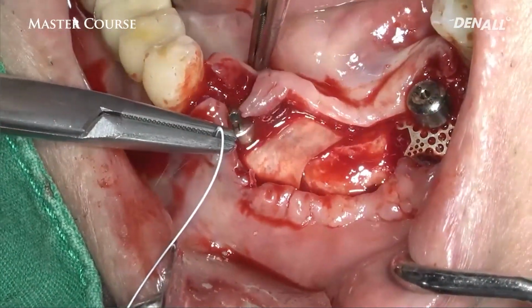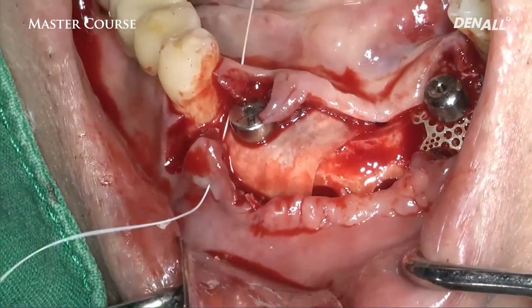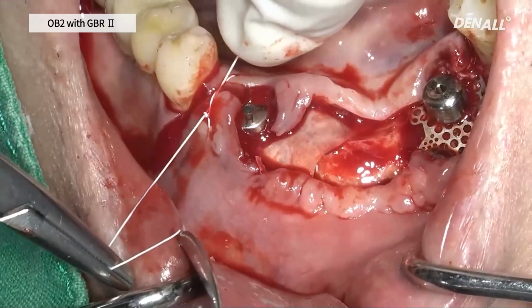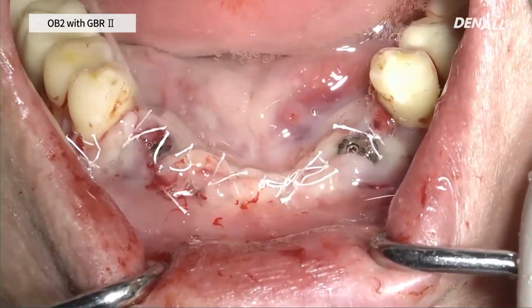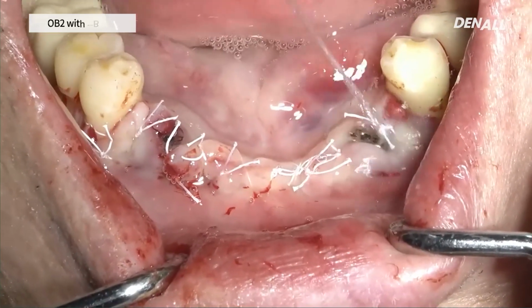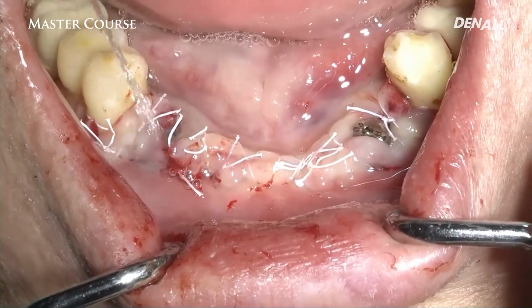In order to fixate the healing abutment and the healing cap, which was used to fixate the Ossbuilder, I'm going to do primary closure. In the case of lower, gingiva is thin. After you use Ossbuilder, in order to cover Ossbuilder, in a lot of cases, Osguide is used.